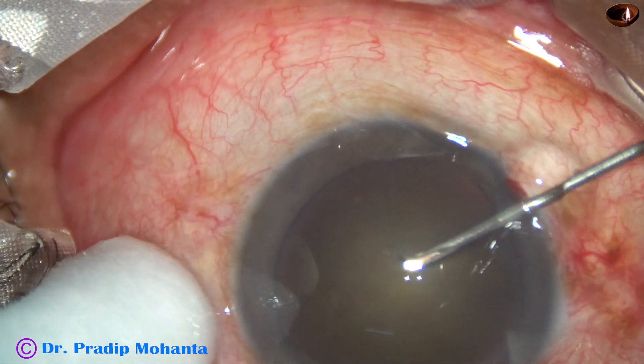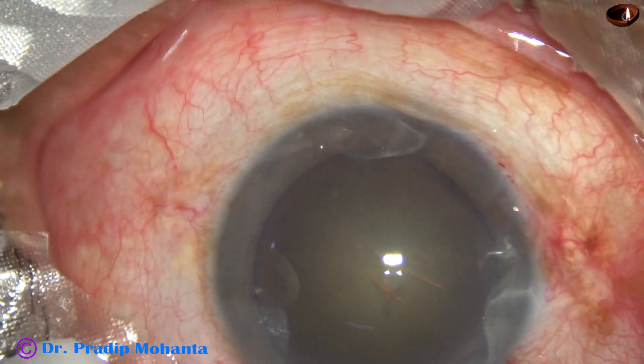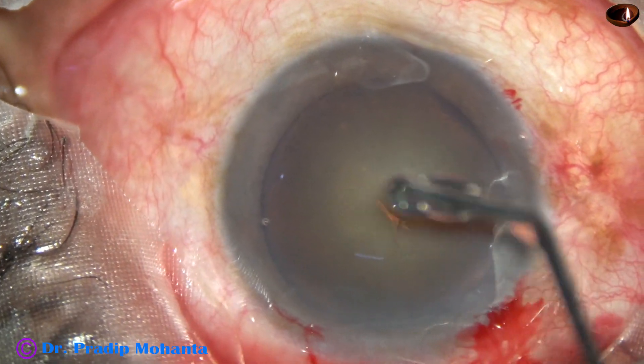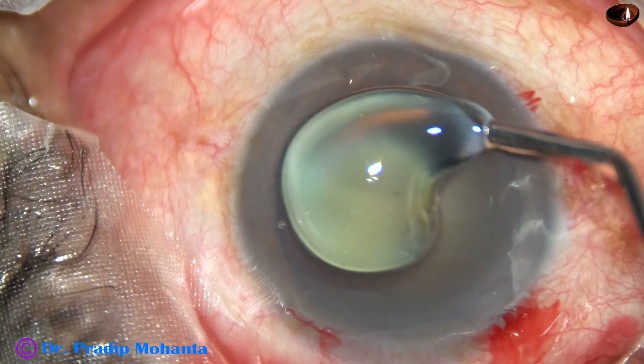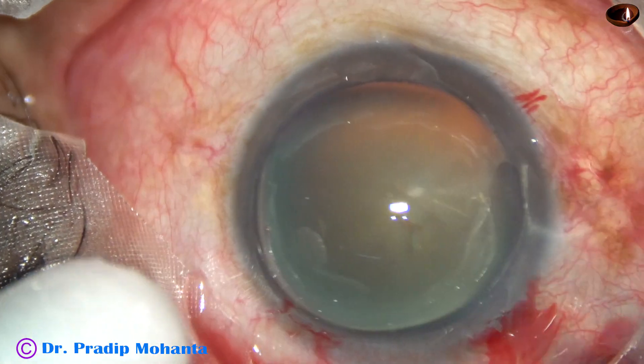Now the anterior capsule is incised with a 26-gauge bent needle cystitome, and a capsular tag is raised. To have better visibility, 2% HPMC is applied over the cornea.